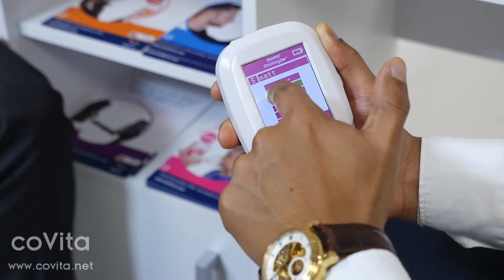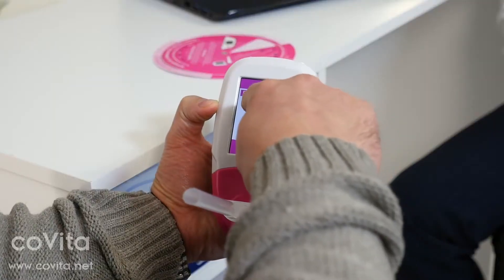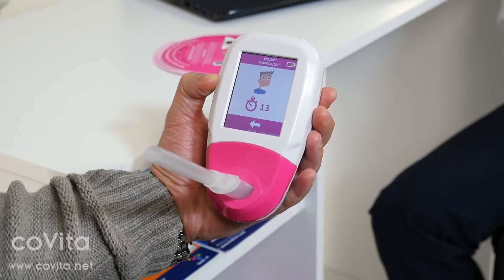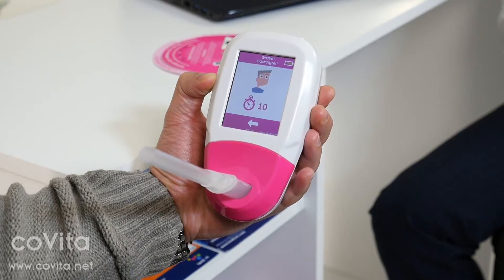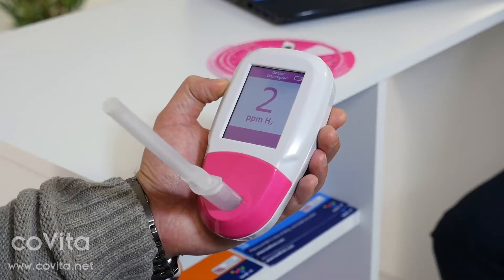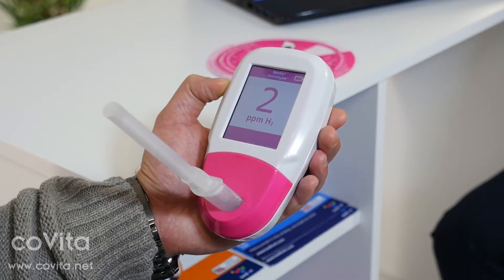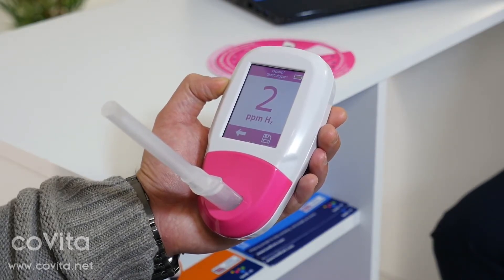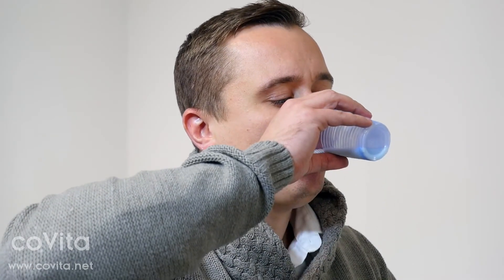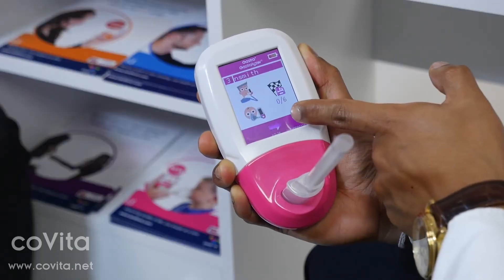The first test will be the baseline reading. Once the patient is ready, they can press the breath test icon to commence the test. If the egg timer displays, the sensor is zeroing. The patient will then be asked to inhale and hold their breath for 15 seconds before slowly exhaling into the Gastro Plus. The PPM levels will rise and hold on screen. The option to save the test will appear on the bottom right, which will save the test to the patient's profile. The screen will then prompt the patient to drink a substrate.